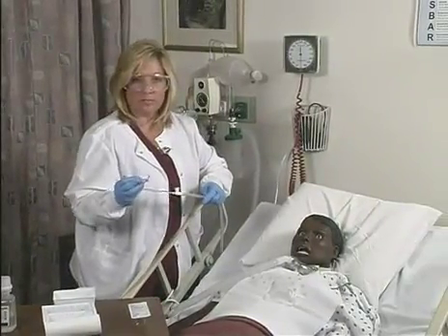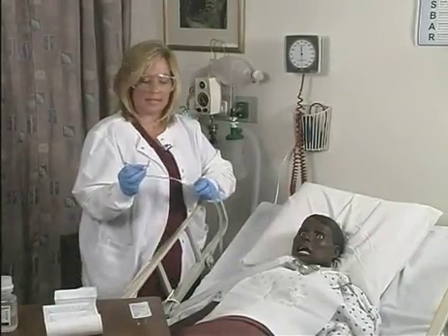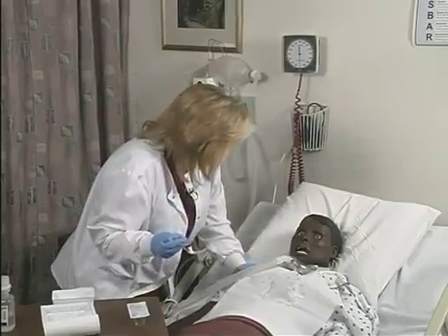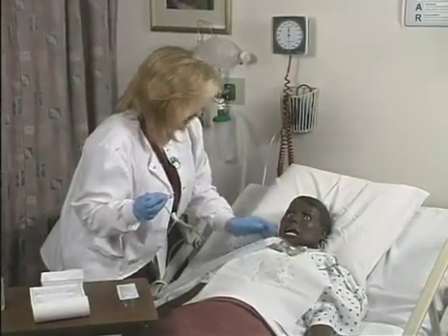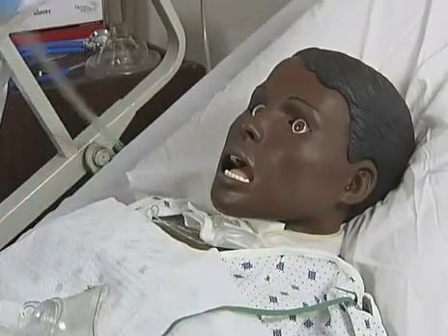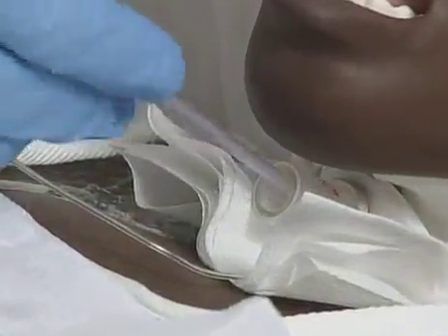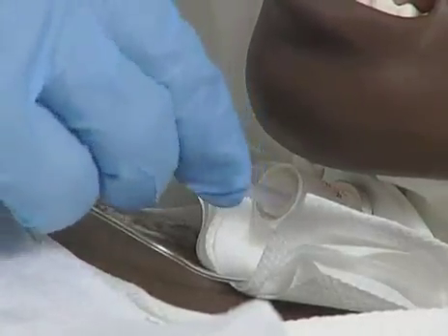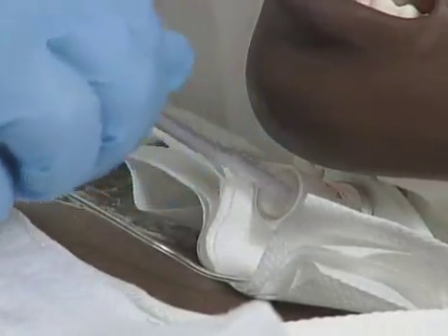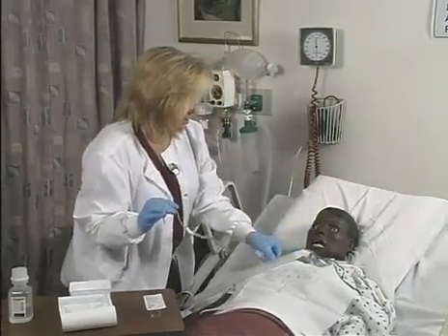Her breathing looks good, her color looks good. I can proceed with suctioning Mrs. Jones for the second time. Mrs. Jones, I'm going to suction you again, and when I do so I'm going to ask you to take another deep breath. You're doing very well. Again, I insert the catheter without applying suction. Mrs. Jones, please take a deep breath and then cough. I apply suction, rotating the catheter as I exit out of the inner cannula. I replace the oxygen mask to continue to oxygenate Mrs. Jones.